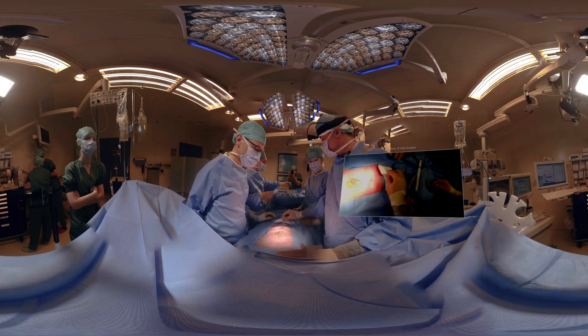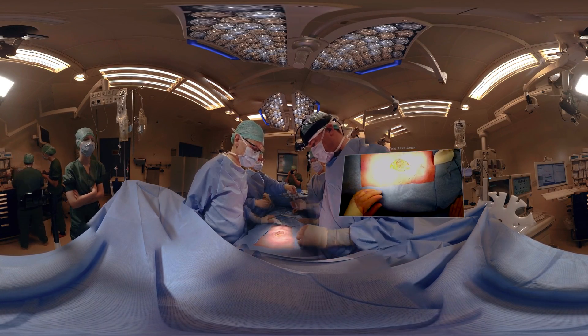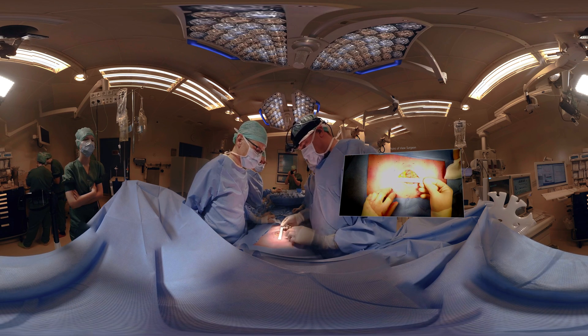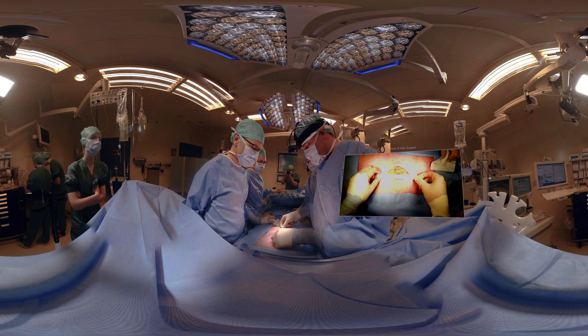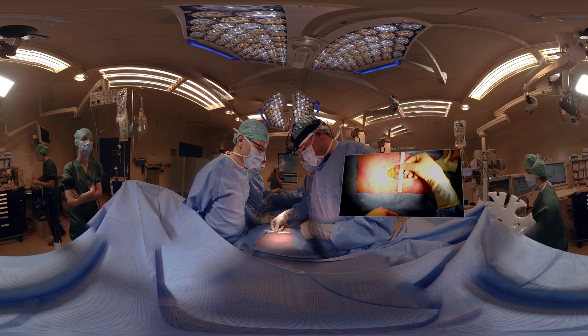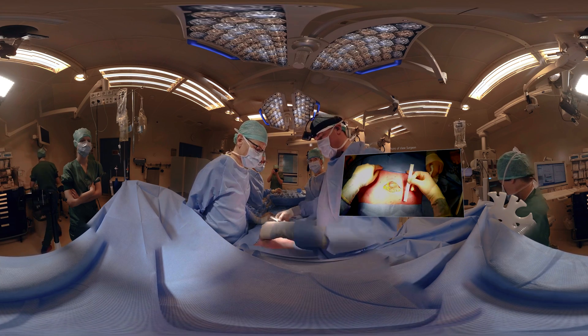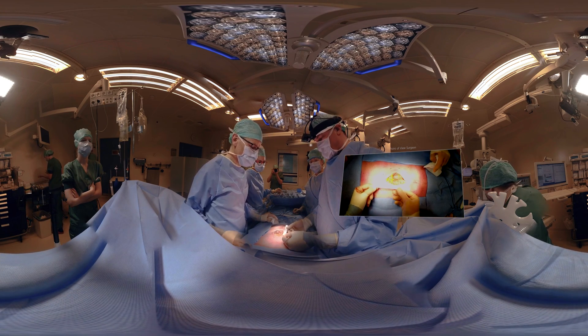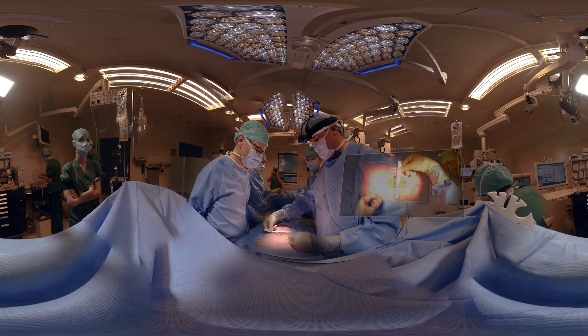This is the size of the defect — we have the ruler here. This measures 15 centimeters, and this is about 11 centimeters. That means we have to add another 10 centimeters for complete overlap, which brings us to a mesh size of about 25 by 20 centimeters.